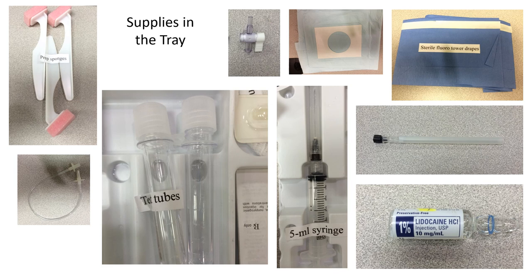You have a set of test tubes for your specimens if they want some. You have your stopcock. You have your fenestrated drape. You have your other sterile drape, usually over the handle for the tower. A 5 milliliter syringe with a needle. Then you have your spinal needle and your lidocaine bottle. It's usually 1% lidocaine. This is a 10 milliliter bottle.